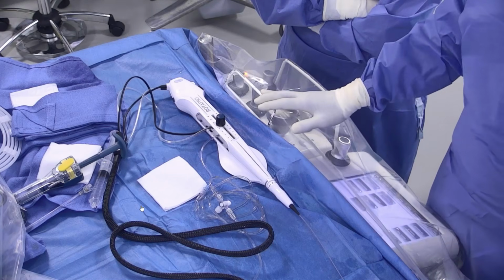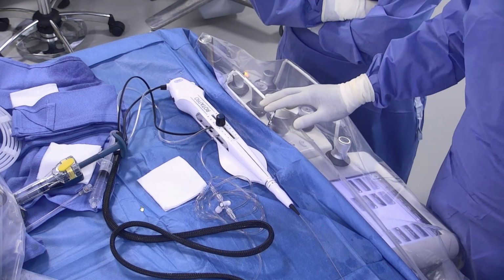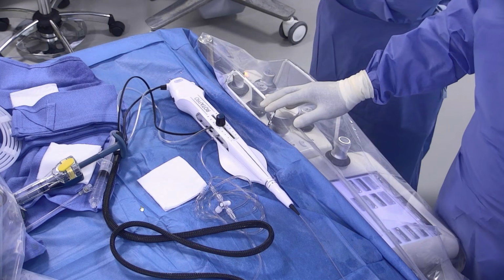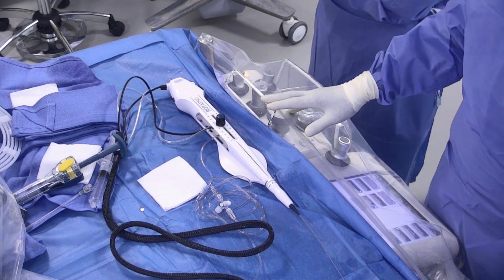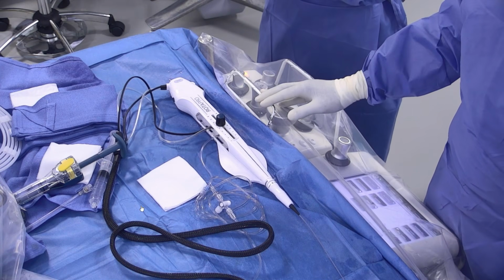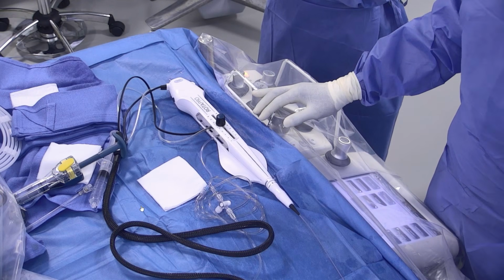So we're ready for the rotational atherectomy. We have selected a 1.5 millimeter burr. We may discuss and describe the rationale for that afterwards. But let me just guide you through the main components of the new RotaPro device. It's really more ergonomic, allowing at the end a kind of single operator procedure. That's very, very interesting. It's a real improvement for us.